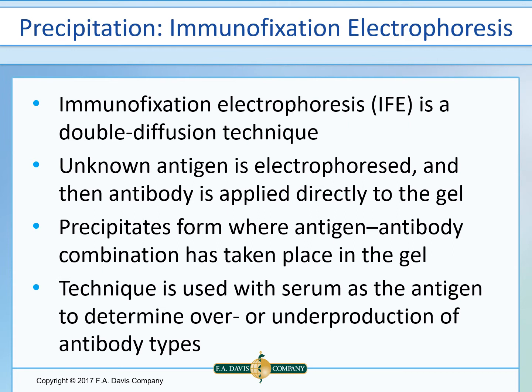Immunoelectrophoresis is a double diffusion technique that incorporates electrophoresis to enhance results. As interpretation is difficult with immunoelectrophoresis, immunofixation electrophoresis has largely replaced the initial method, and this gives faster results and is easier to interpret.